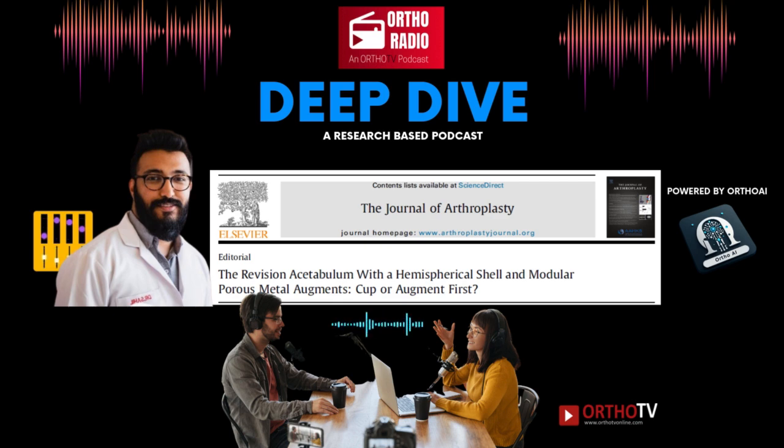Before we get into that debate, I think it's important to lay some groundwork. We're talking about cementless fixation here. Can you break down why that's so important? Absolutely. Cementless fixation relies on intimate host bone contact and minimal micromotion for biological fixation. That means you need good contact between the bone and the implant, and very little movement at that interface. This allows the bone to actually grow onto the implant and make it a part of the skeleton. So it's not just filling the space. It's actually becoming one with the bone. Exactly. It's a really cool process.